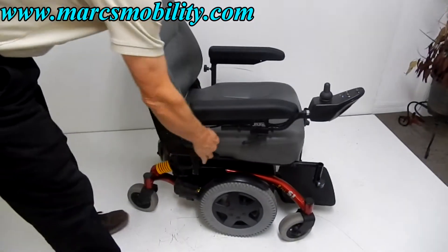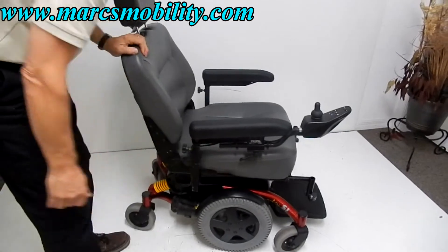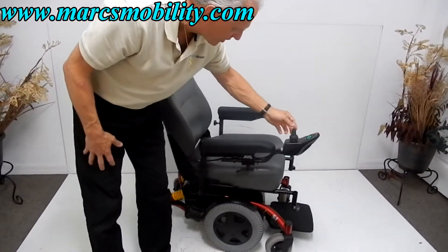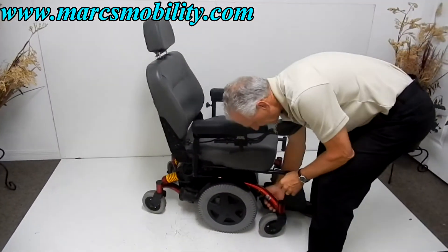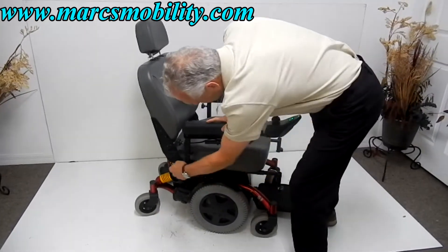The seat is adjustable — there's a handle here and you can adjust the seat. The joystick — I'm going to turn the chair back on. You can see the suspension also on the chair. If I raise the front, you'll see the suspension of the motor. So you have suspension here and you have suspension in the back.